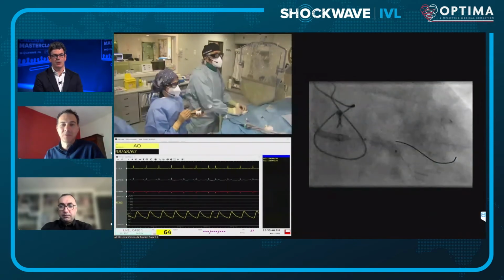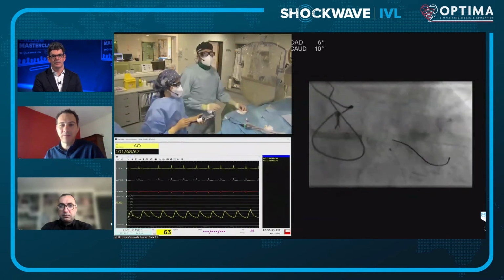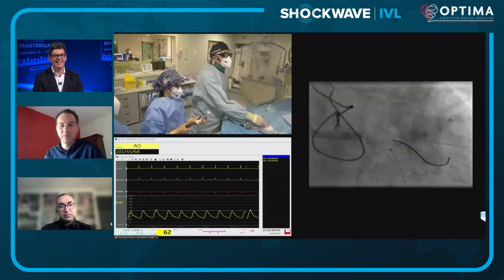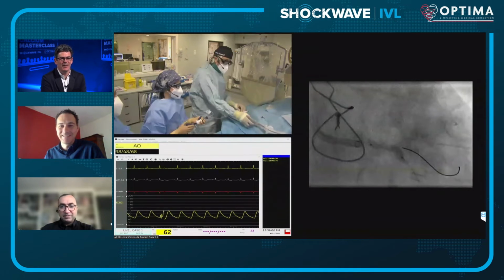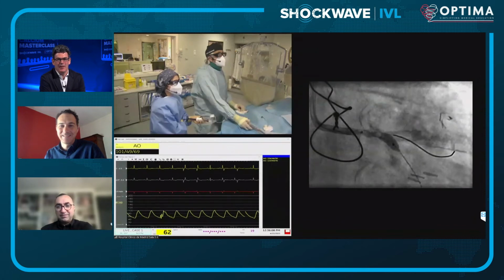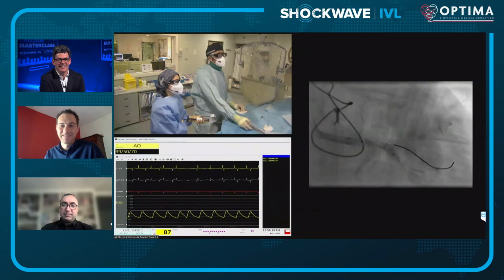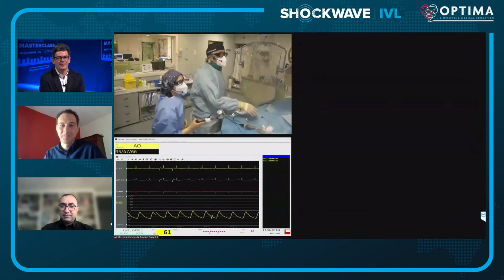So maybe with small movements of the balloon. John and Ravia, do you think it's also an advantage to have this side branch wire in order maybe to crack or to make a scoring balloon effect? A sort of poor man's cutting balloon type thing. I don't know. It may be. I'm sure someone could do a study on that. The energy is hammering over the wire. I don't think that 4 atmospheres will contribute greatly to.